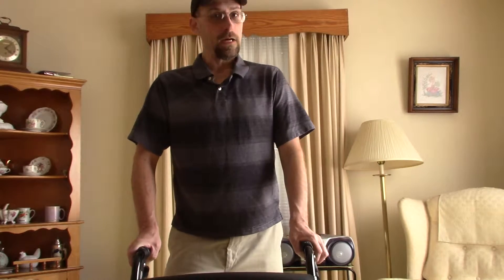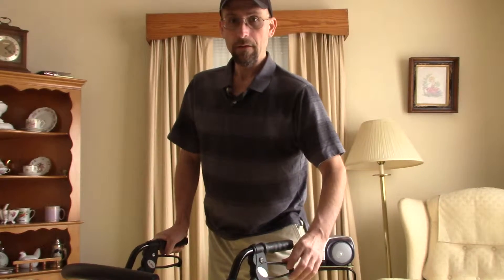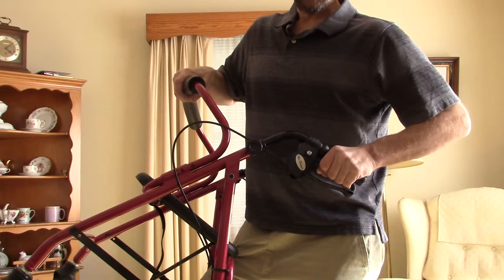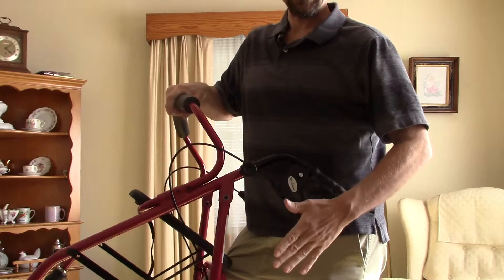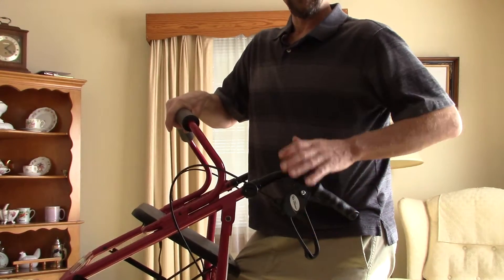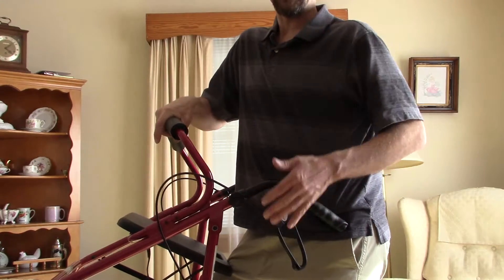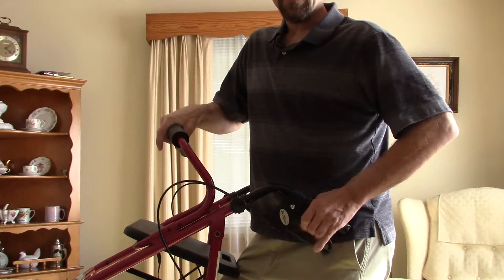This particular model, like a lot of rollators, has a grip brake, but it also has a locking brake. You pull up to grip it for a quick stop. You can also lock it by pushing it down — that way, if you're standing somewhere for a bit, you have a firm brake so your rollator won't go rolling away. To release the brake, just pull back on it and you're good to go.